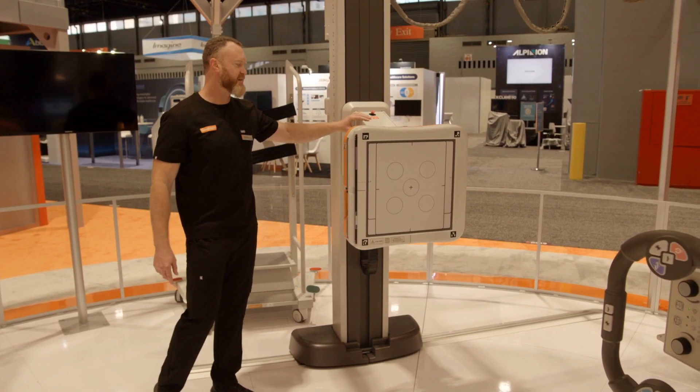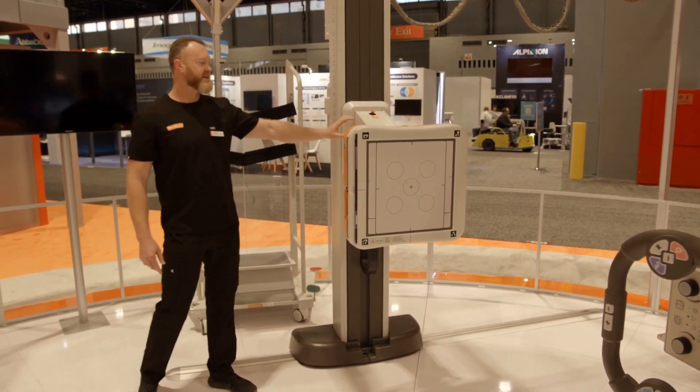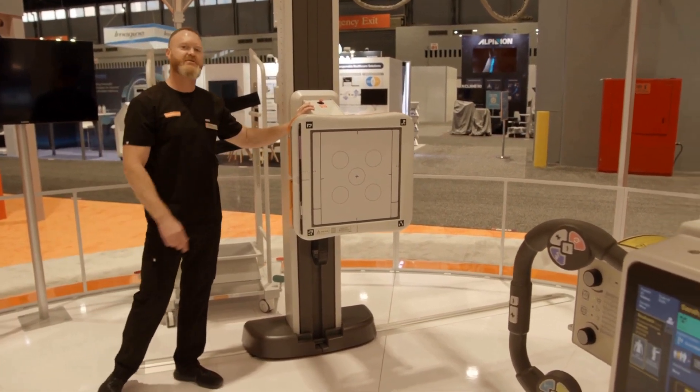Once we have everything lined up, I can tell the tube to track the wall stand. And as I move the wall stand from side to side, my tube is going to follow.